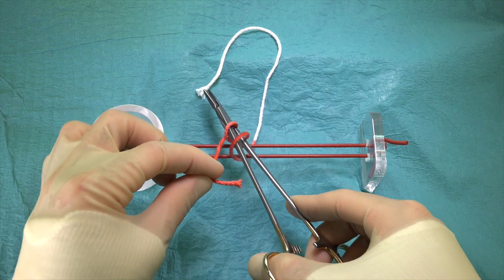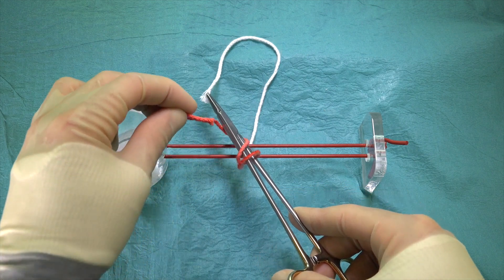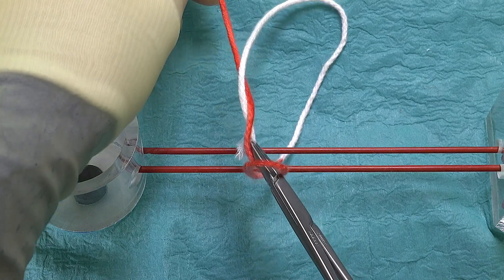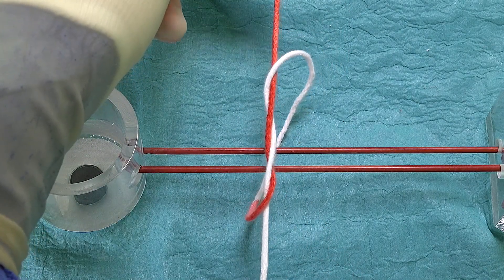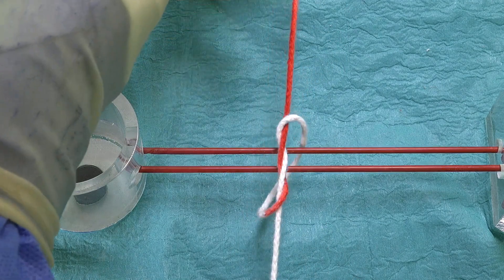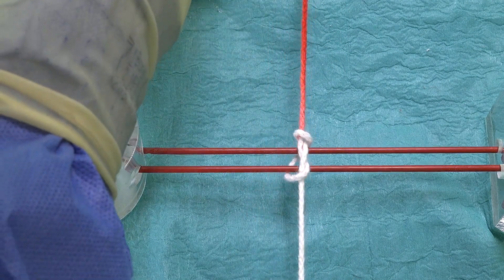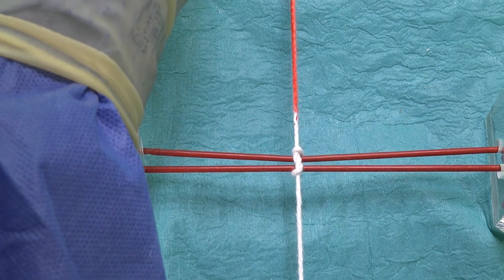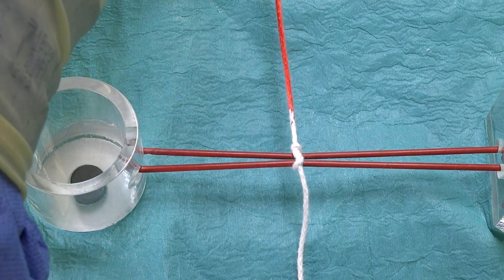The instrument is then used to pick up the end of the suture that lies away from us, and this is then pulled towards us through the loop in the process, whilst the left hand moves away from us at 180 degrees. This process of crossing the hands allows us to nicely lay the double throw of the suture.